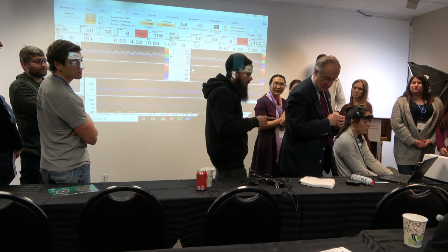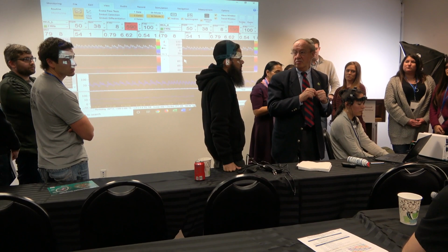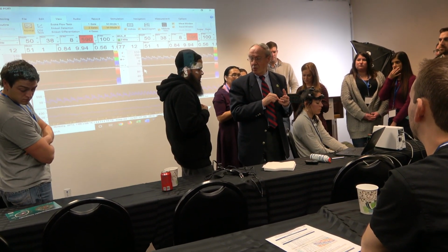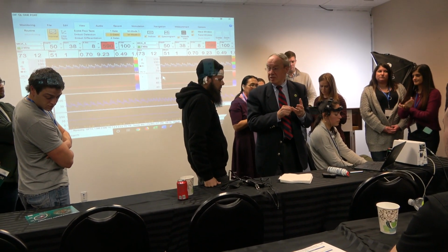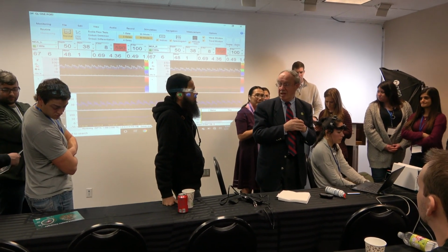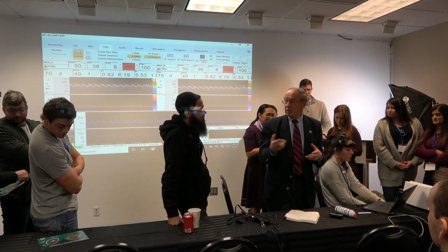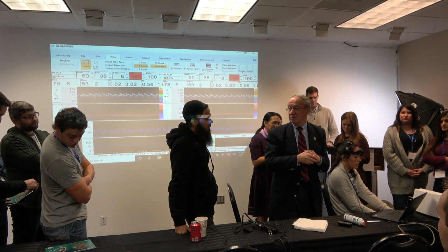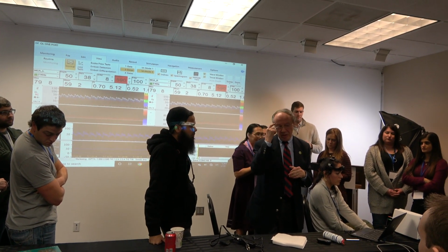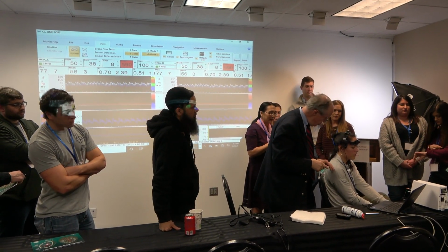So we can monitor any intracranial artery? Not any. Only arteries involved in the circle of Willis. MCA M1, MCA M2, anterior cerebral artery A1 segment, terminal segment of the ICA, and of course we can do right left vertebral or basilar, but not all at once. Fetal PCA? Rare, but with diagnostic study, yes, you can find it. And not PCA, just normal PCA? Yes, PCA, yeah. From the temporal window, usually we're starting studies. Are you okay? Yeah.